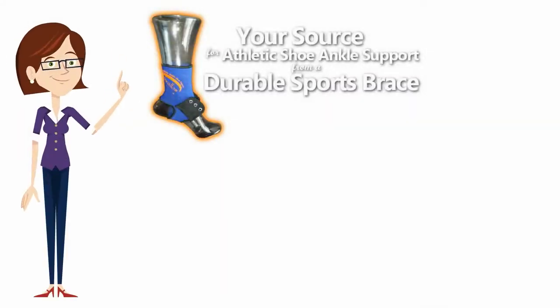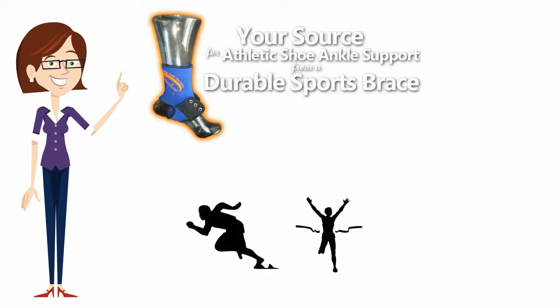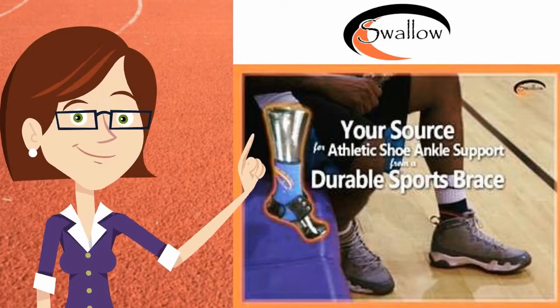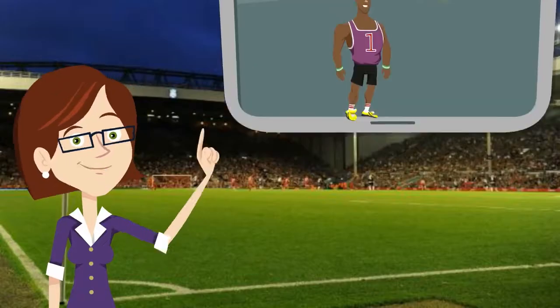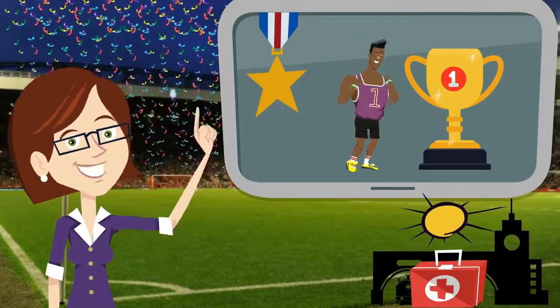Swallow Ankle Brace is made from durable materials to provide support and comfort for stiff, weak, or injured ankles. Swallow features a lace-up technology that gives you excellent support with the ability to alleviate your arch for better performance in the sports arena, medical industry, and everyday wear.